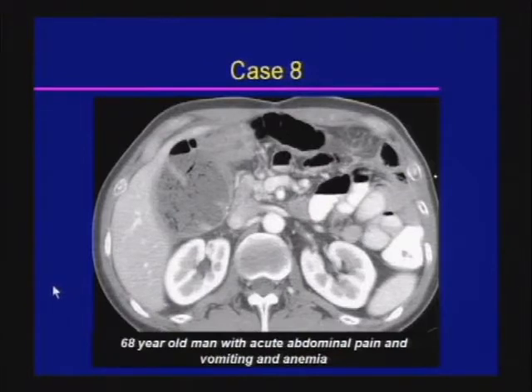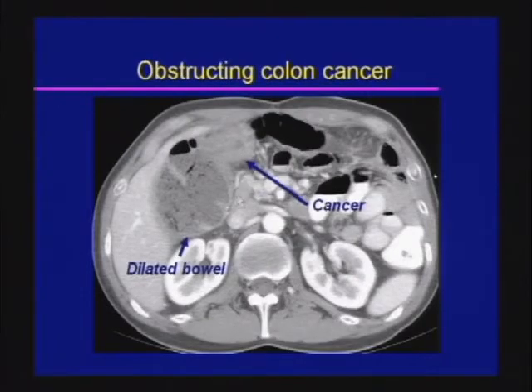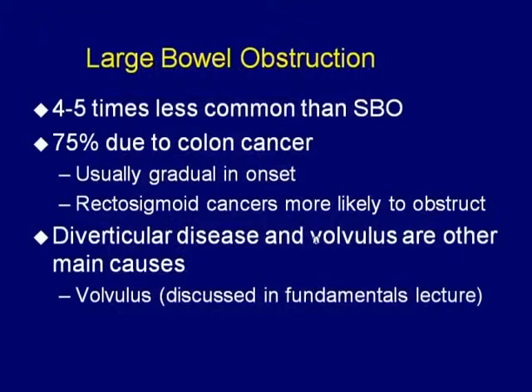Case eight: a 68-year-old man with acute abdominal pain, vomiting, and anemia. The colon shows proximal distension with an abrupt transition where the bowel wall is thickened and the lumen is narrowed — a case of obstructing colon cancer, the CT equivalent of the apple core lesion on barium enema. Large bowel obstruction is significantly less common than small bowel obstruction, and the vast majority are due to colon cancer. Rectosigmoid cancers can present acutely given the narrower lumen and harder stool in that region. Diverticular disease and volvulus are other main causes.